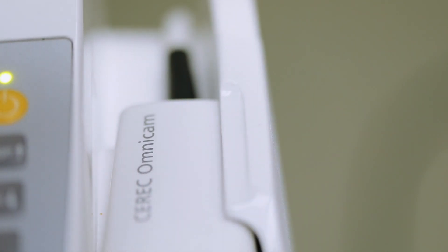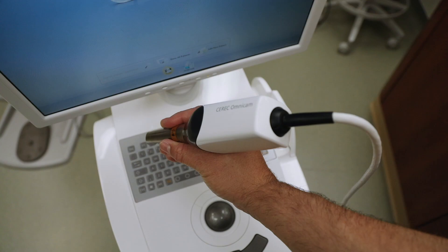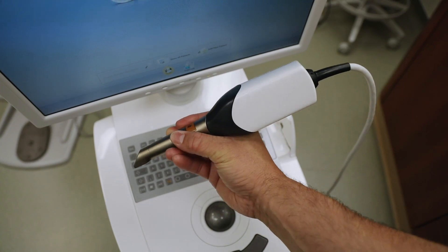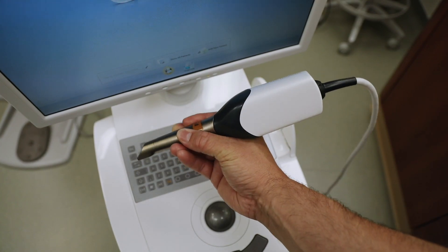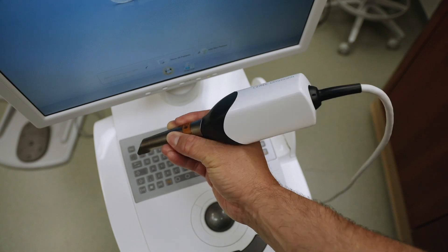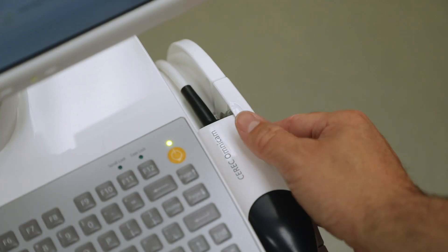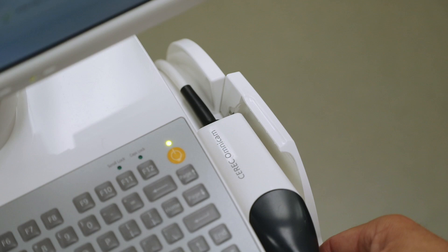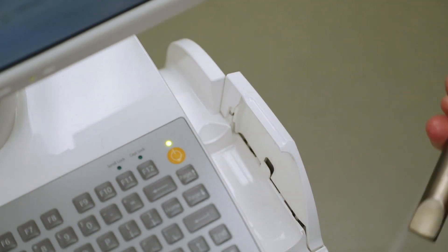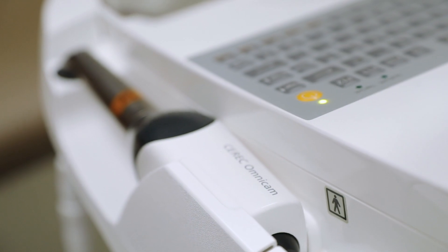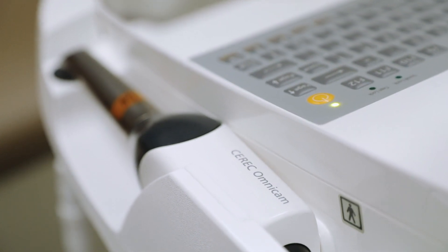When you are ready to use the Omnicam camera, unlock it and pick up the camera. The camera is held the same way you would hold a handpiece. Where the camera lens touches the main part of the machine, you will see a black circular area with an exclamation sign on it. This is the heating element.